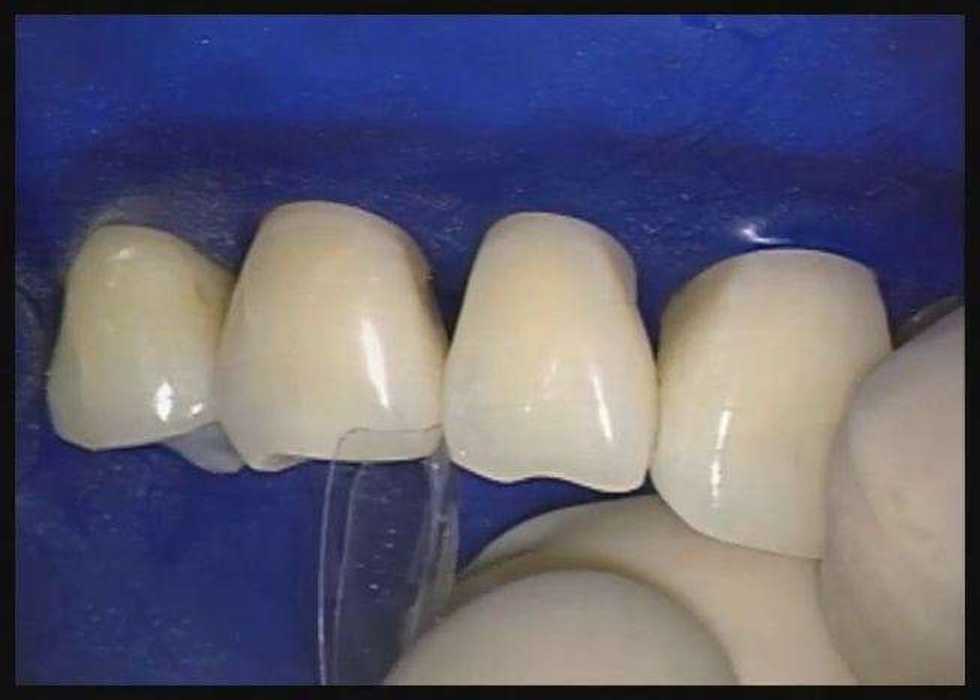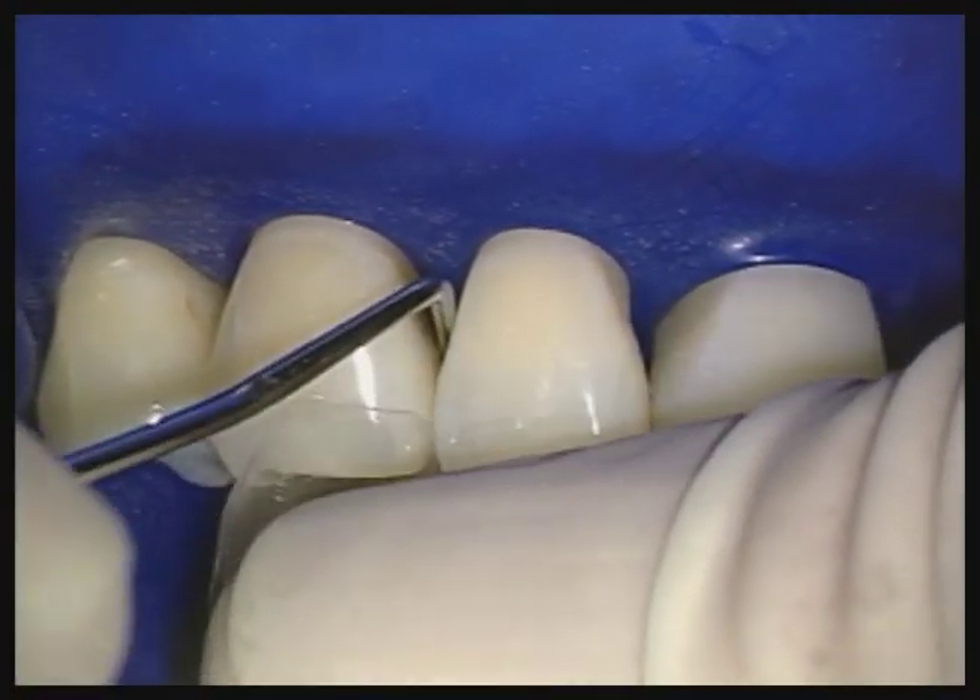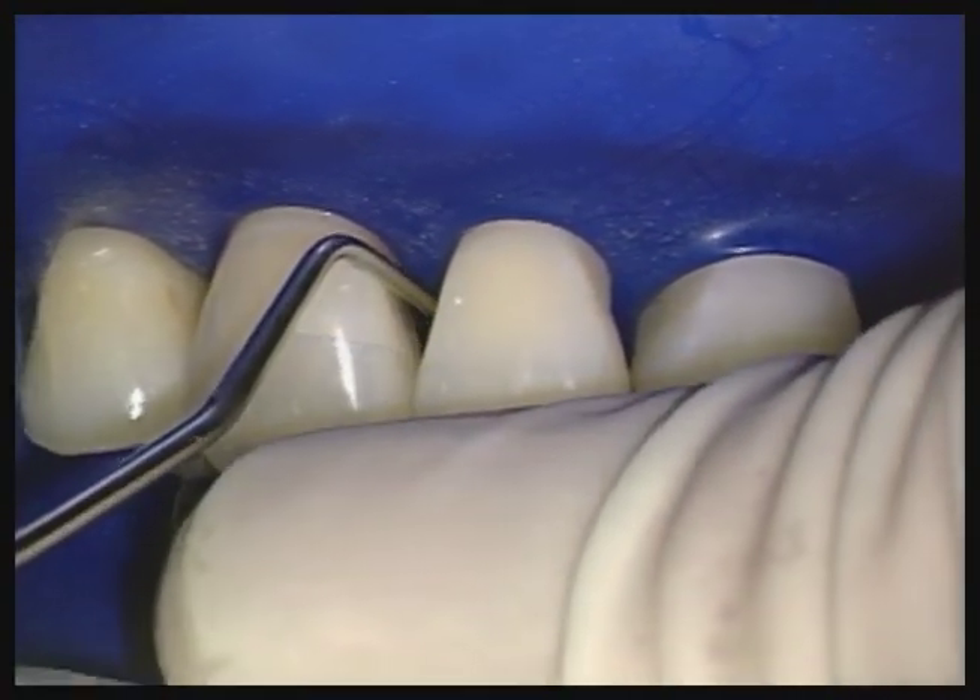Because the clear mylar is more delicate than a metal strip, you will need to gently separate the teeth to be able to place the matrix.